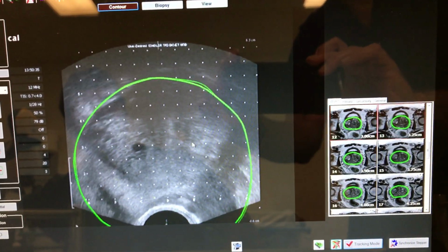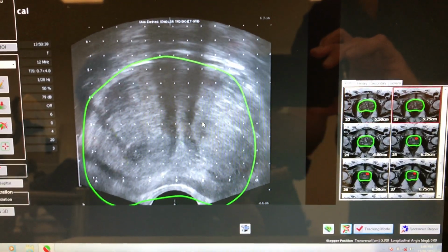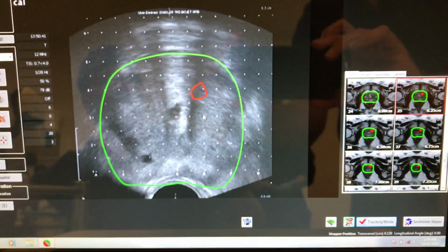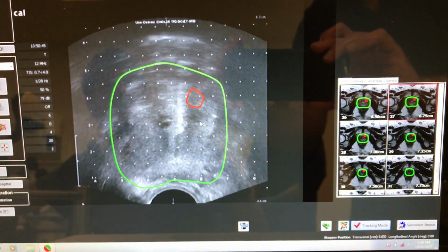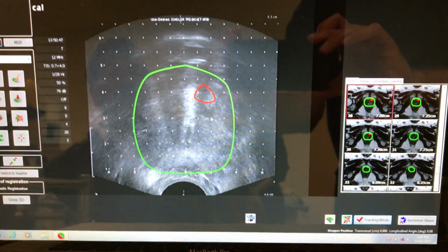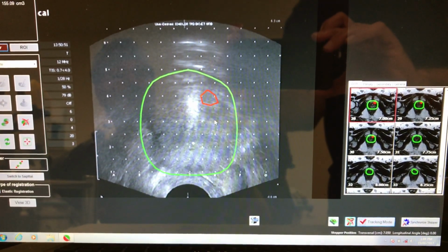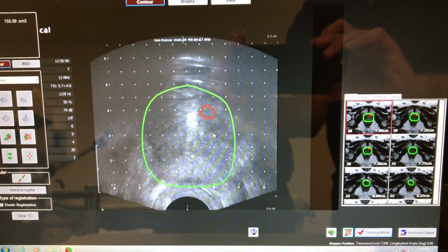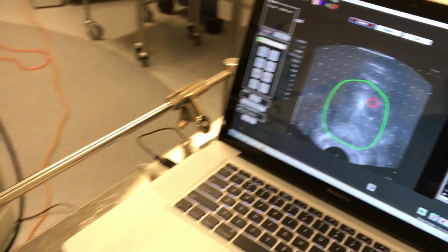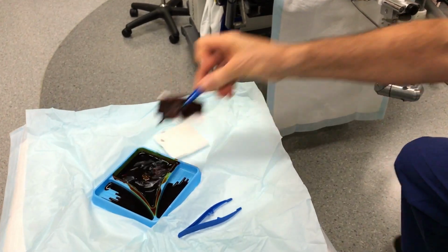So let's go back to the area of interest. And once again, it's important to realise that the bottom edge of it is not that important. Now you go down to the most distal limit of that area in question, so around here, because the needle should be hitting there and then going in from there. Next thing to do is to prepare the skin, then put the bracket on, and then the minimum number of cores is 4.